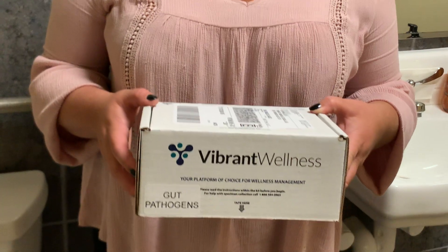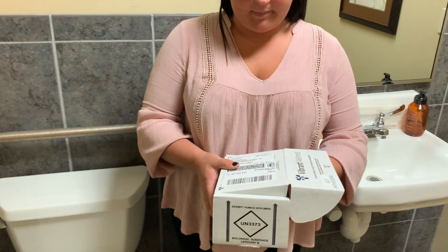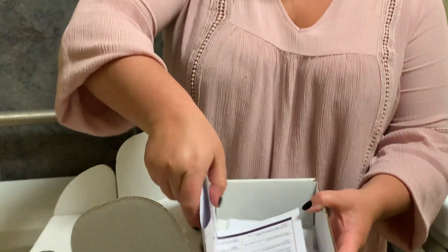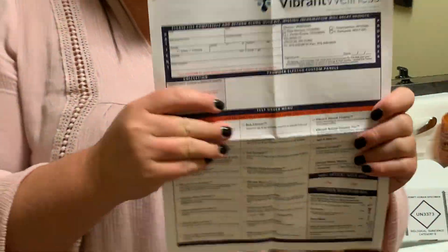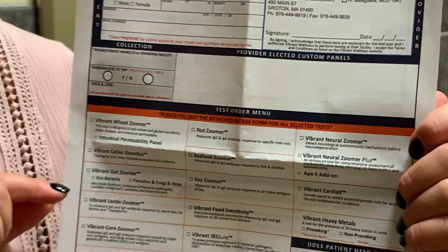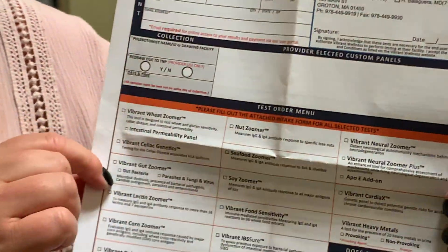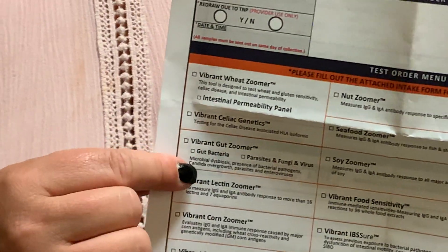When you get home, make sure that you have everything that's necessary in your kit, so go ahead and open it. First, make sure you have your lab requisition form. On the requisition form, we should have filled out your name and date of birth, signed the form by the physician, and checked off that you need the Vibrant gut zoomer.